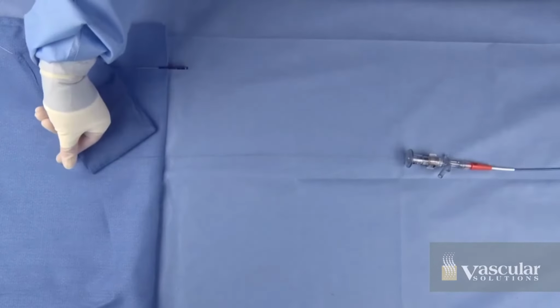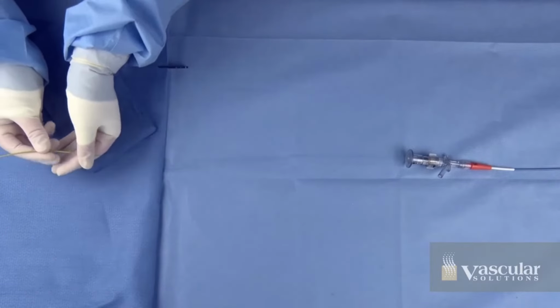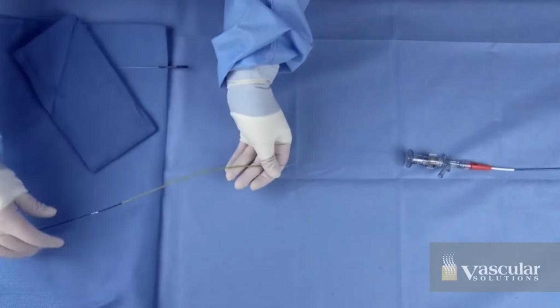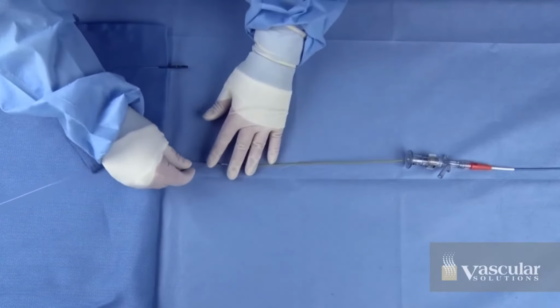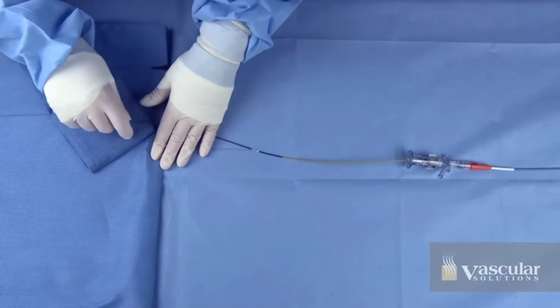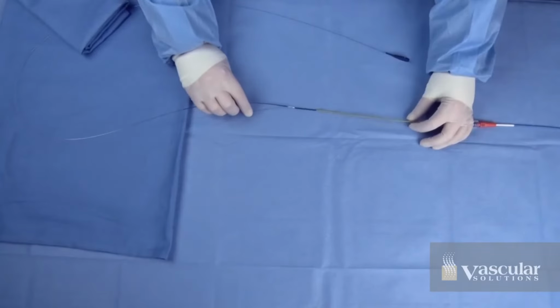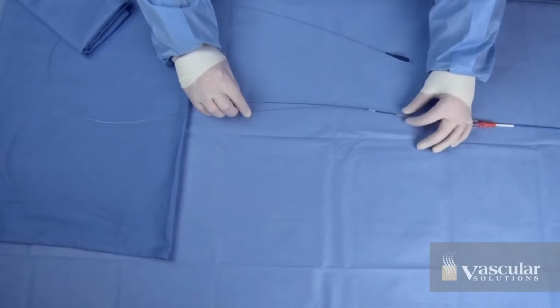Secure the previously inserted guide wire and backload the distal tip of the GuideLiner catheter onto the guide wire and advance until the catheter is just proximal to the hemostasis valve. Open the hemostasis valve and advance the GuideLiner catheter through the hemostasis valve and into the guide catheter.